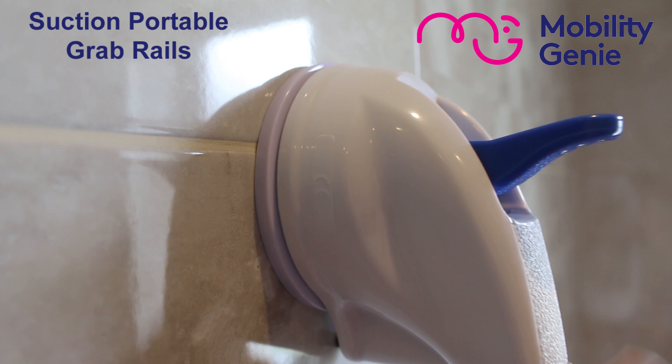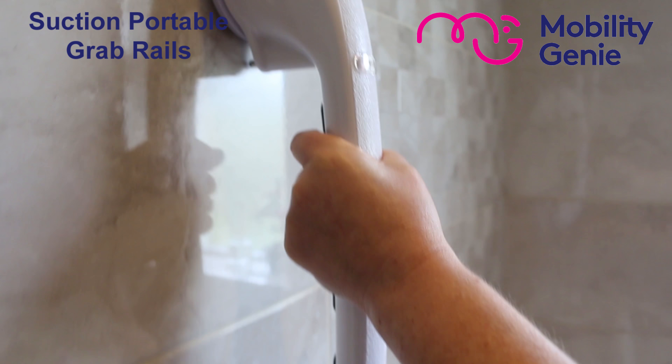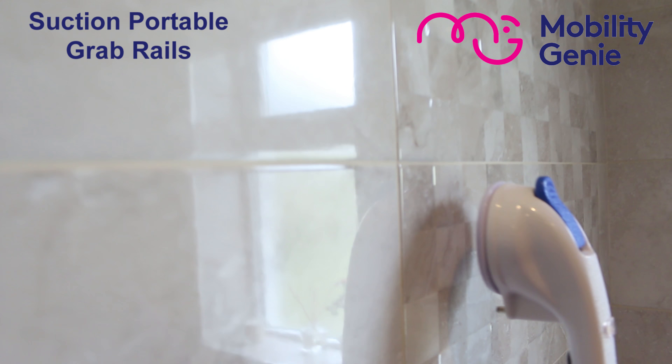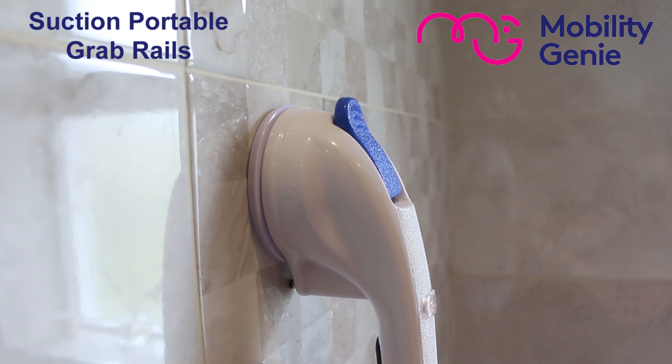In my mind a suction grab rail is ideal for a temporary solution, provided the instructions are followed extremely carefully — for example if you're going on holidays and you're not sure whether they have a grab rail, or if you're going to a friend's house where they may not have a grab rail.